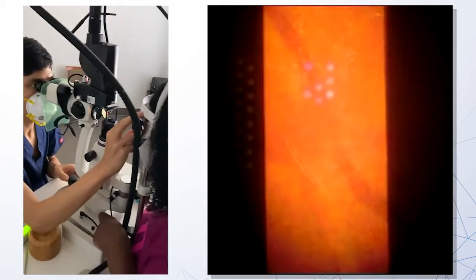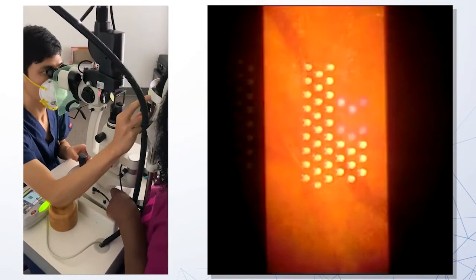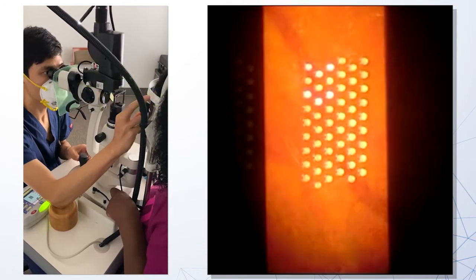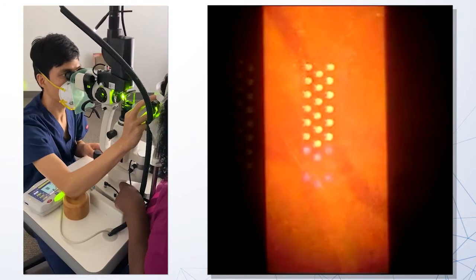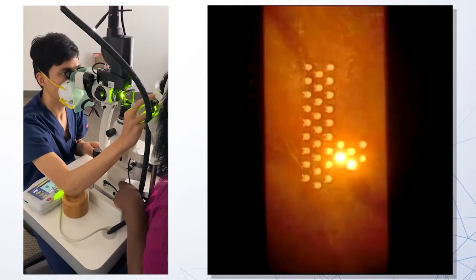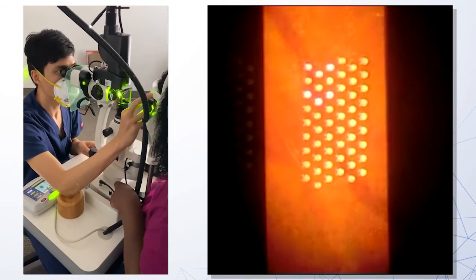In this video, I'm performing a PRP grid laser with the auto-forwarding feature. If I keep my foot on the pedal, the laser automatically advances to a new area and delivers nine spots of a square 3x3 grid to each area. One can customize the grid to make it smaller or change the shape, as it has 22 selectable patterns.